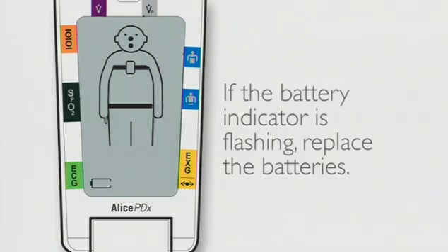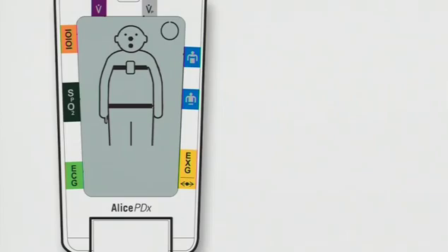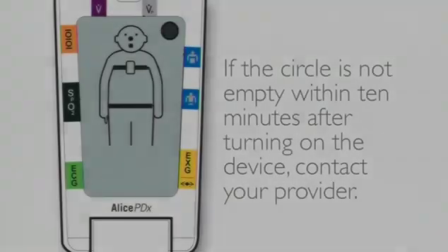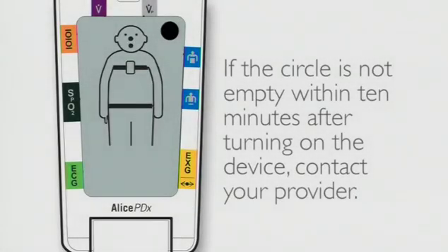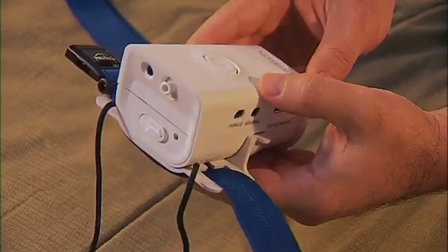Refer to your manual or contact your provider for appropriate instructions. The memory card symbol will flash when the card is nearly full — if this happens, call your provider. The good study indicator circle should be empty, which means it is ready to collect data from your study. If the circle is not empty within 10 minutes after turning on the device, contact your provider.